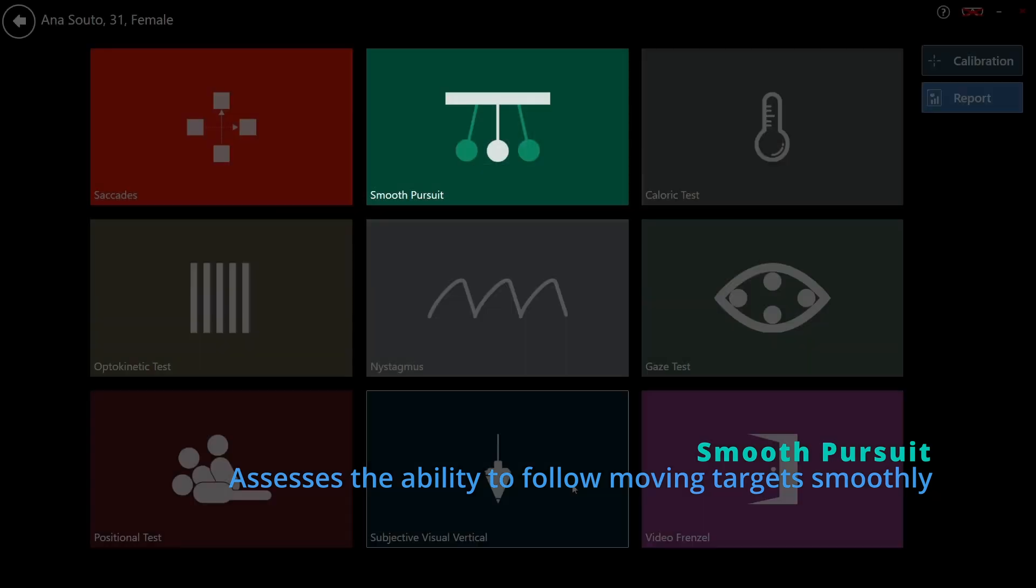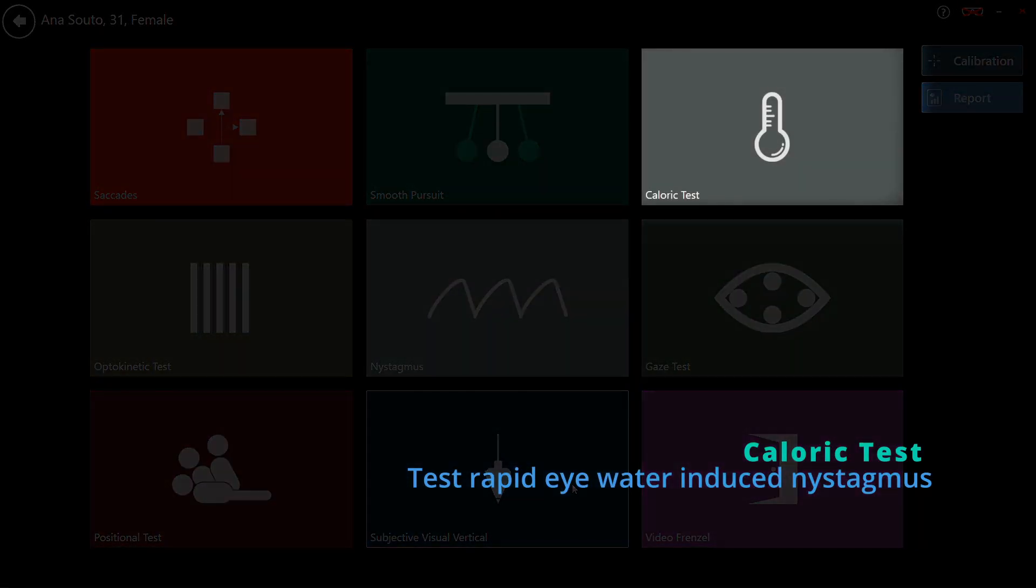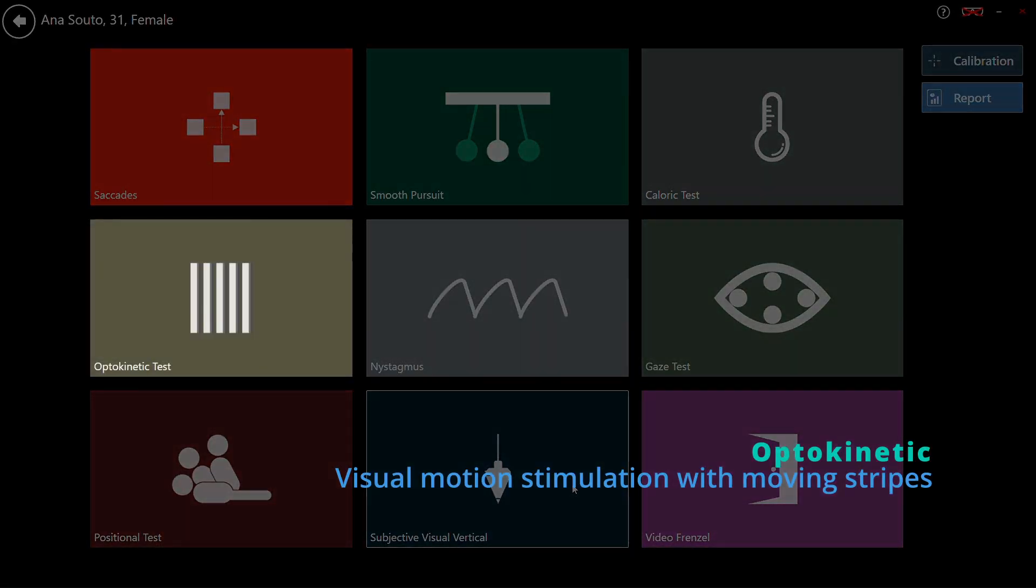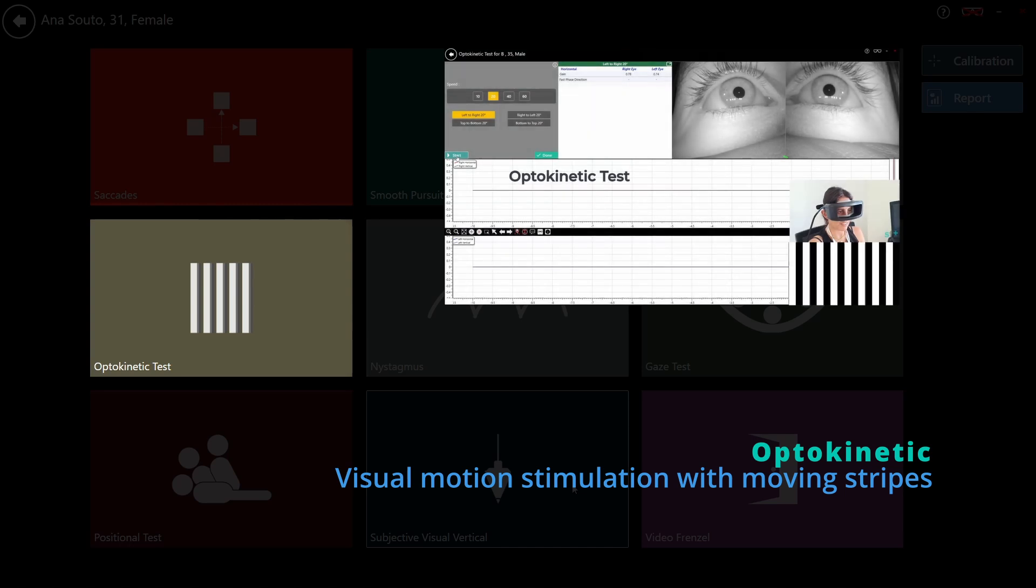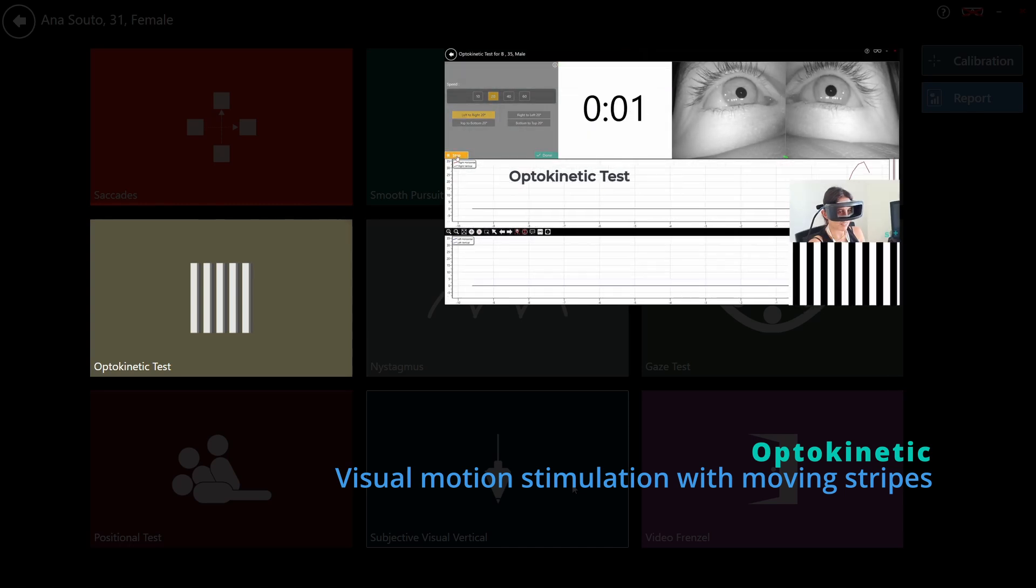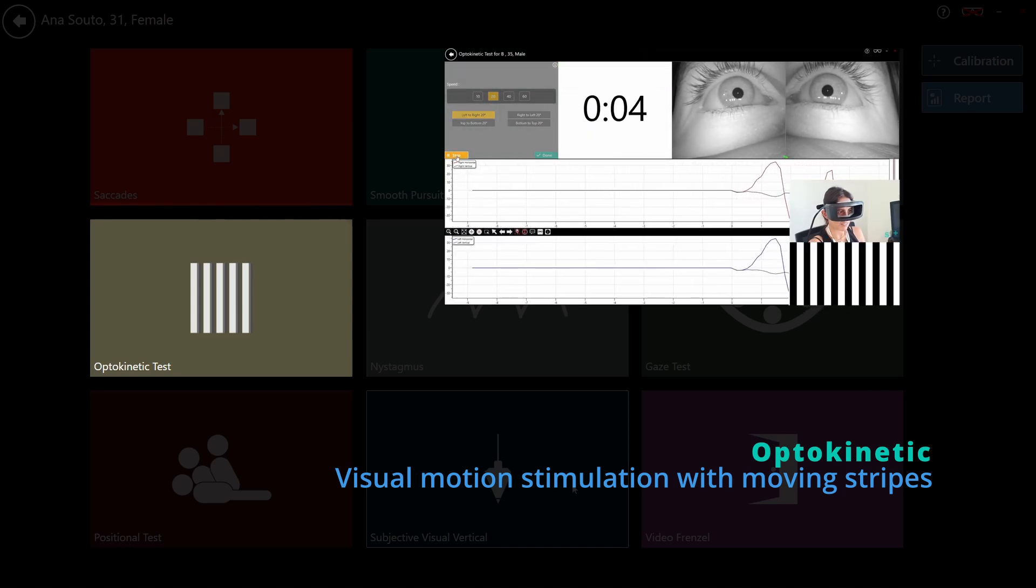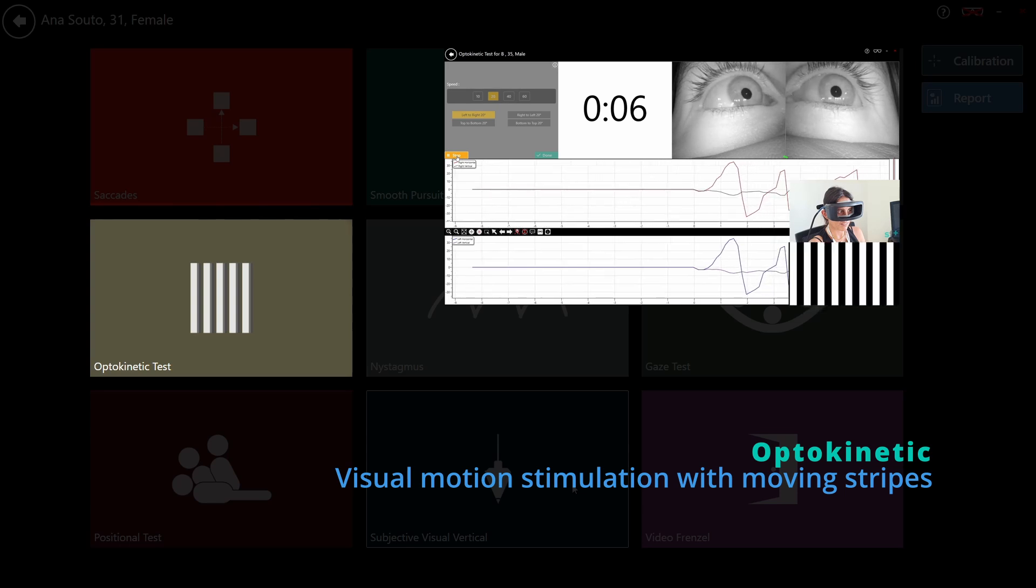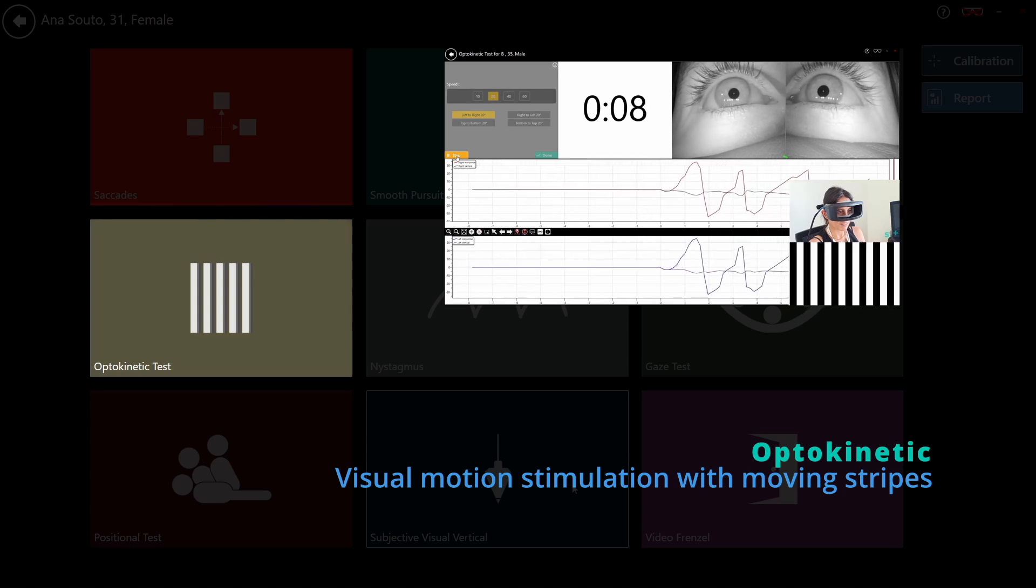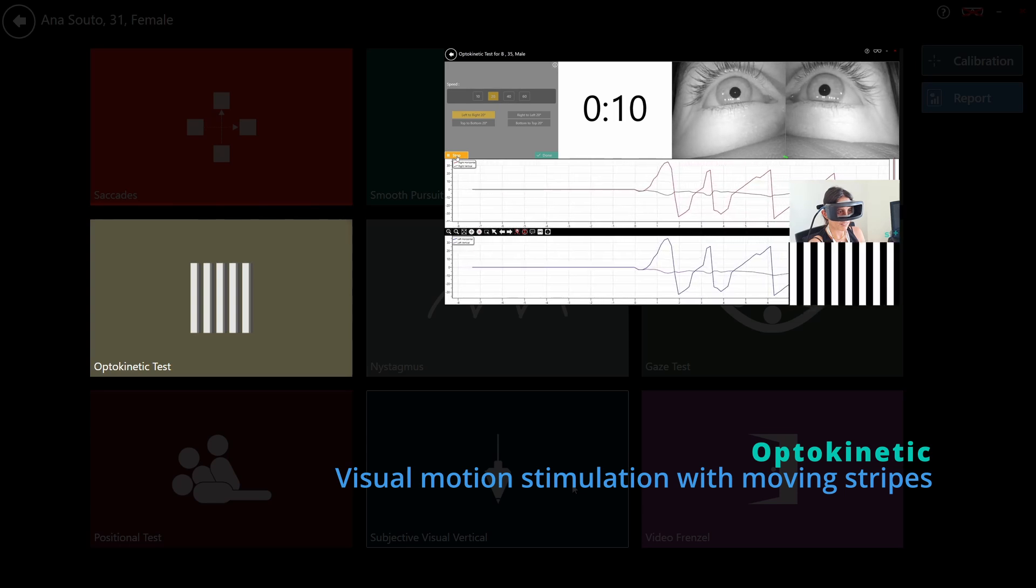Caloric test using warm and cool water or air, this test stimulates each ear independently. Optokinetic test alternating black and white bars move across the screen to provoke reflexive eye movements. Gain ratios are calculated by comparing eye velocity to stimulus velocity, identifying central or peripheral deficits.